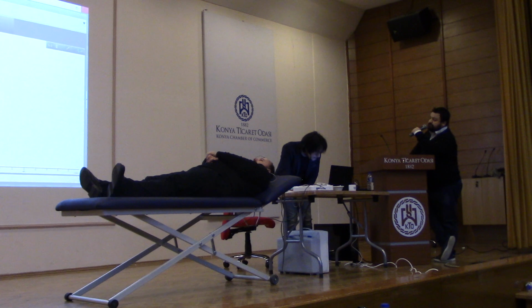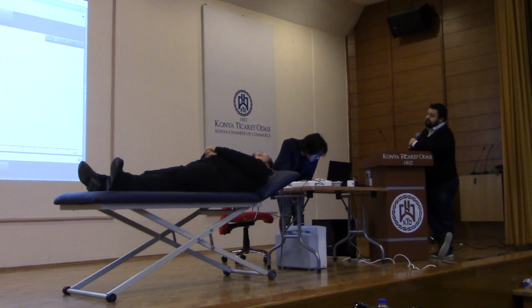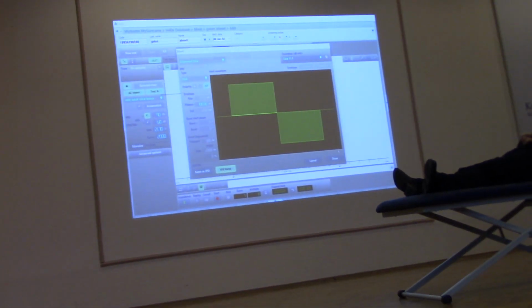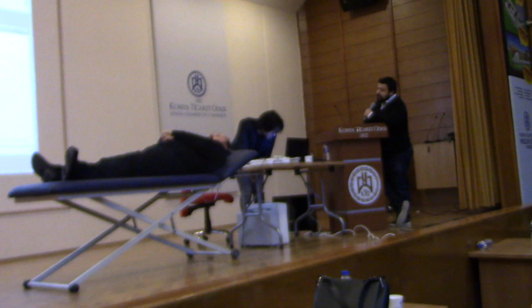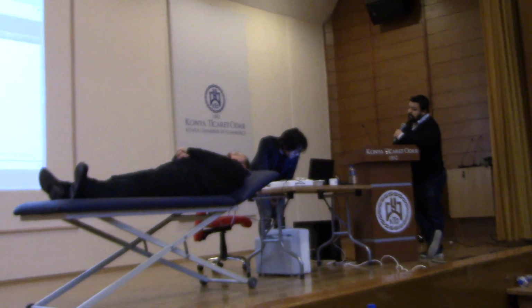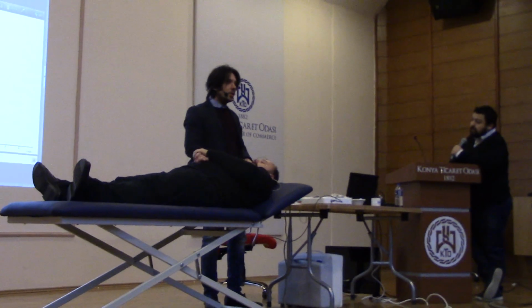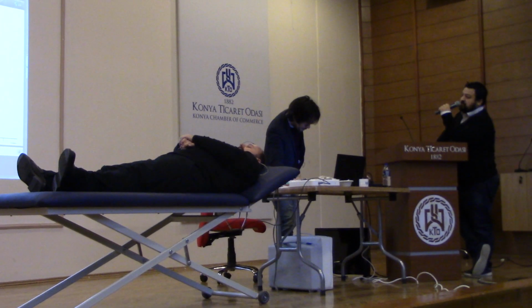Then, we are using an alternate click at 100 microseconds. Alternate polaritede klik uyaran kullanılacak. We just can start our test. Remember to wear the headphones on. Kulaklıklar, insert kulaklıklar takılı durumda.